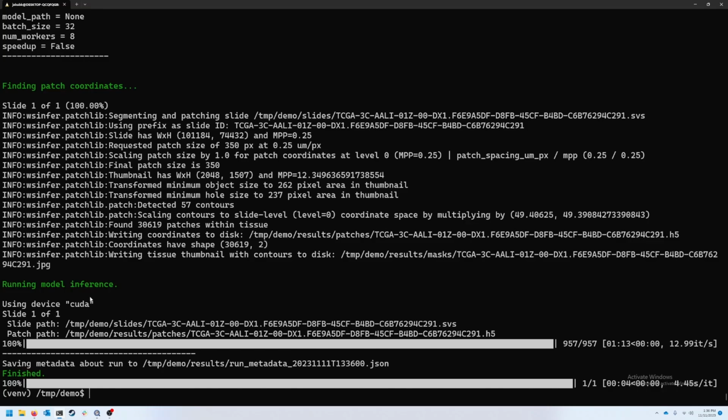In the last step, it also converts the model output to GeoJSON, and GeoJSON is a JSON format that is great for representing spatial data. Spatial data can include polygons on whole slide images, for example. Each of the patches is a polygon, and we associate the model outputs with each patch, and so that GeoJSON can be loaded into QuPath.